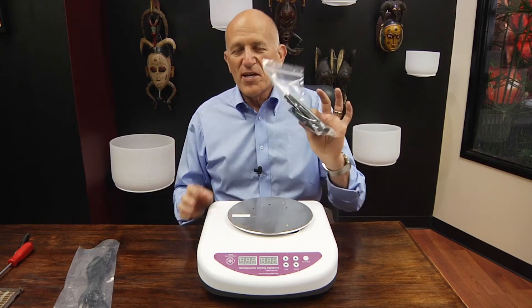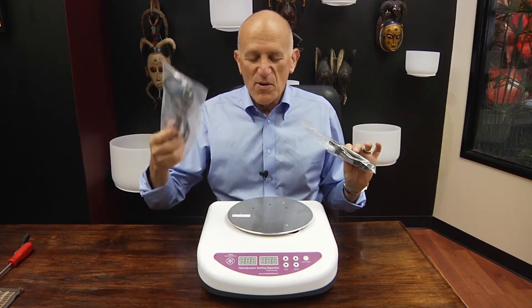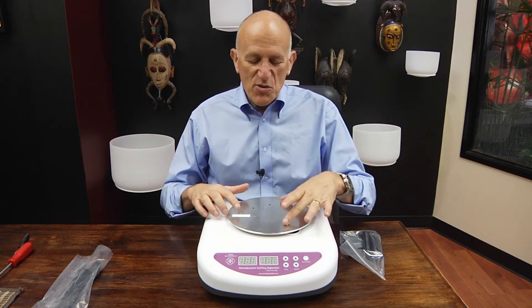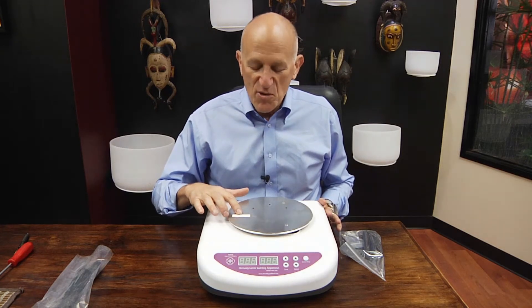This is the cradle mechanism right here, and this video is to show you how to attach the cradle to the plate, and of course the power cord. The first thing I need to point out is that these screws are not the same. These two are long, and this is a shorter one, and the shorter one has to go into this particular hole.